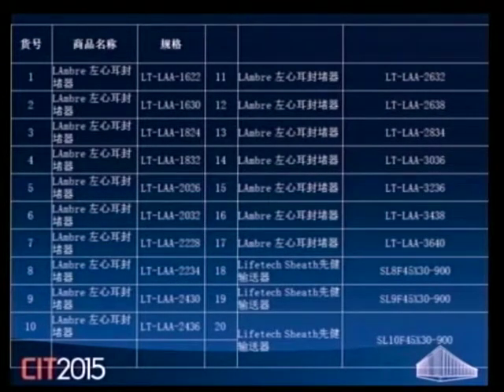Can we see the device? We see only the chart now. We haven't packed out the device, so we will pack out the device now. 2834. So you are oversizing by 4 millimeters, right? Yeah. Normally it depends on the space behind the neck.